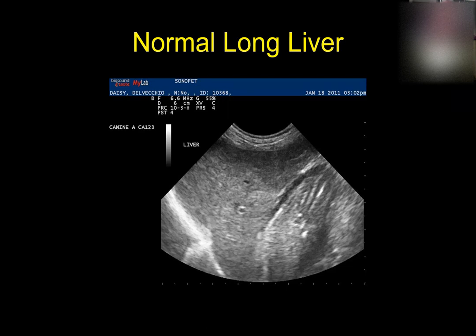If you get one of those slices and you hold it up to the air and look at it before you eat it, if that slice looks normal to you, does that mean the rest of the hunk of the roast beef is normal? Absolutely not. And so if I look at this one slice of liver, I can't tell you if the rest of the liver looks just like that or not.